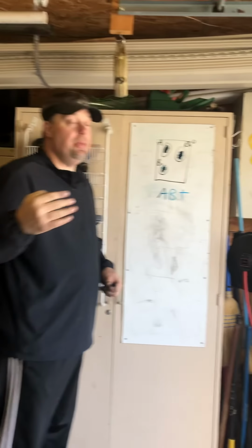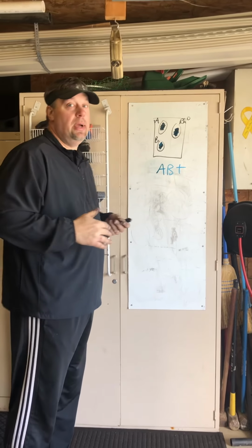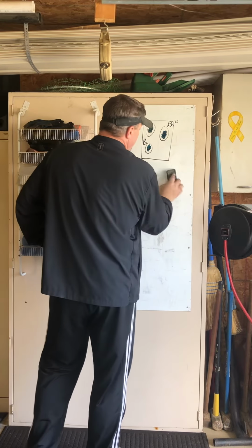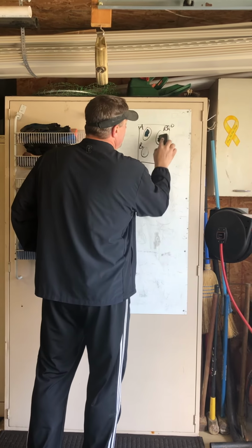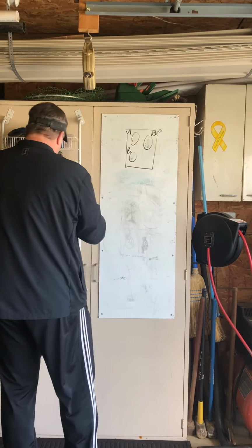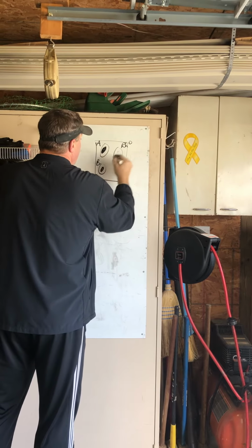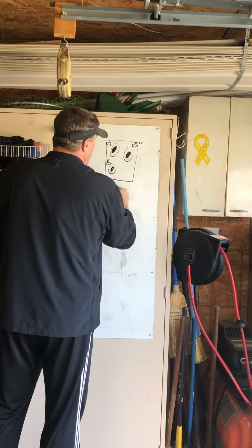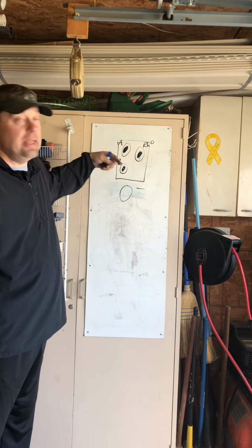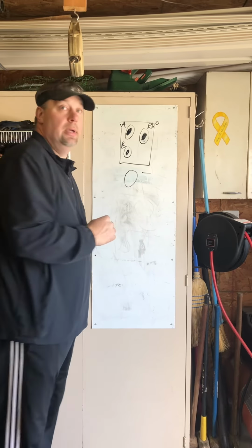Now, blood typing is something you either get or you don't. If you don't get it, email me and I'll try not to confuse you and maybe we can get it figured out. One more just before I stop here. I don't even know if I can post this on Blackboard, so hopefully I can. What if none of them clump? What do we have? We have O negative. Because again, O is not flying any flags. So no antigen, no antigen, no antigen, O negative.